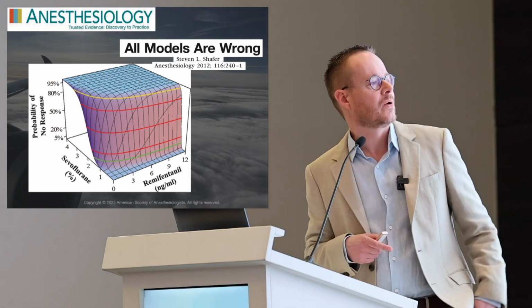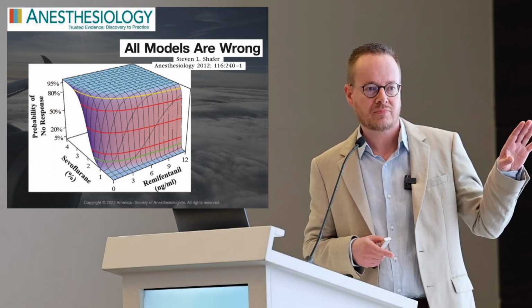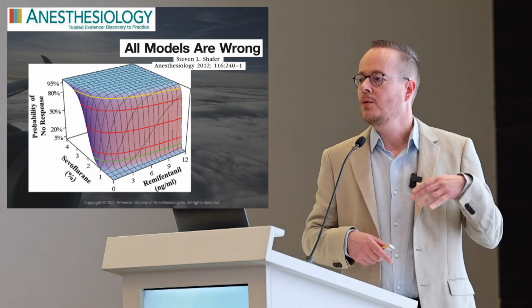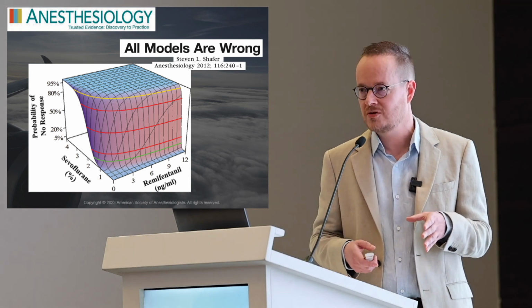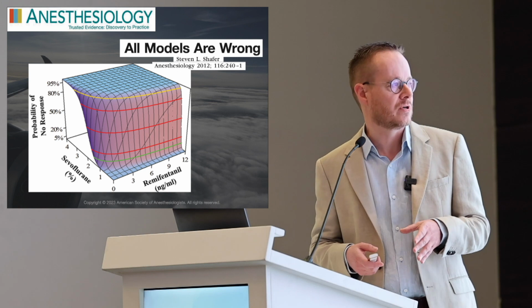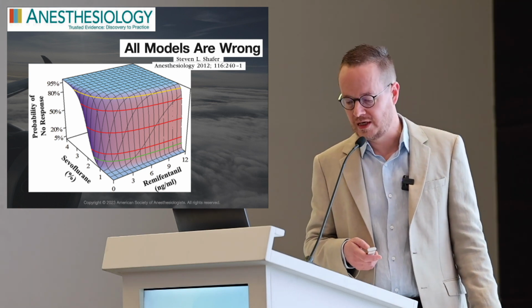No. Okay. So on the third axis we have the clinical effect. For anesthesia, we are typically interested in an effect that is no effect. So the effect that we want is no response. For example, here we have no response to intubation.